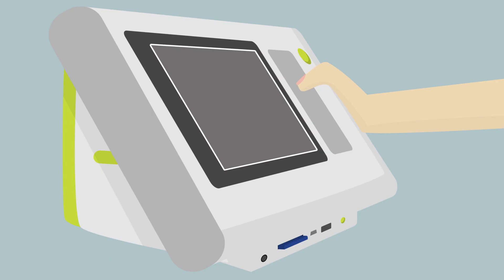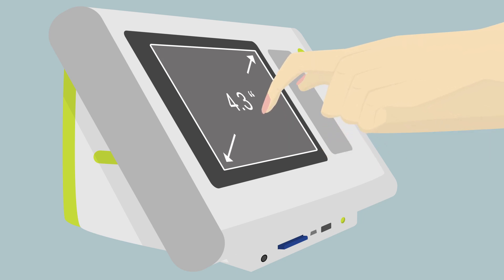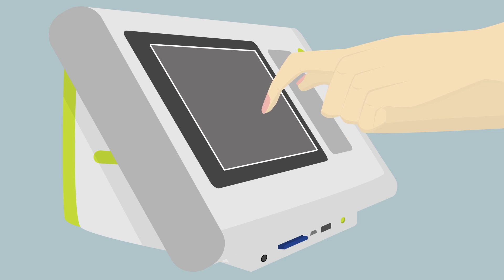The PlusOptics A12C model has a 5.7 inch capacitive screen. Capacitive means it will respond to the skin of your finger or a stylus touching the screen. The PlusOptics A12R model has a 4.3 inch resistive screen. Resistive means it will respond to the pressure of your fingernail or a blunt pen tip touching the screen.